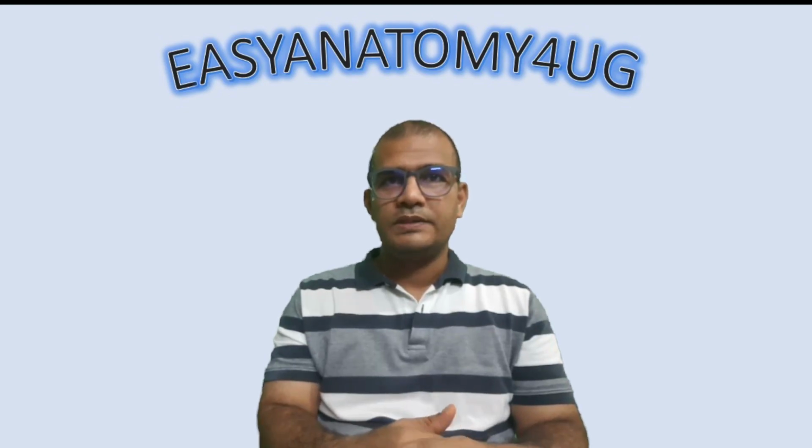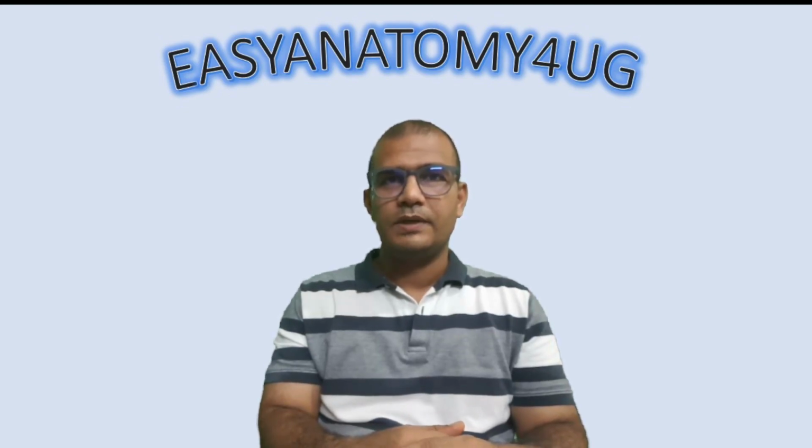So I will not make this lecture a detailed one, but I will keep it short and we will discuss only the important things in the histology slides that are important from the theory point of view, as well as we will discuss a few important viva questions.